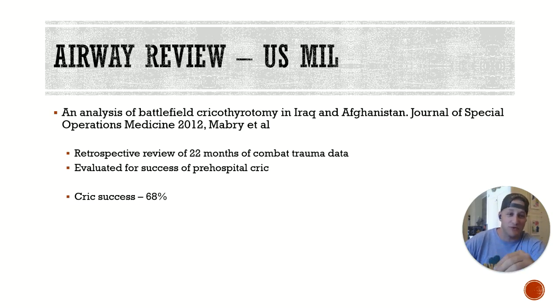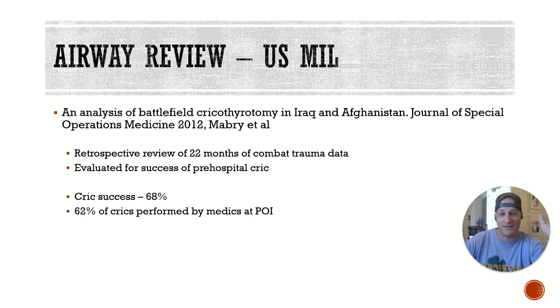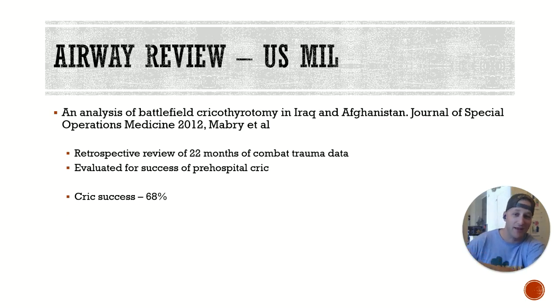All right. If we're saying the airway is a huge problem and it's potentially fatal if you don't have a secure airway, you just cannot tolerate 2/3 success. That's awful. Okay. 62% of the crics performed by medics at POI. Just to labor this again, like 3 out of 10 people who got a cric made it to the hospital without their cric working. Do you think any of those people survived? They certainly all died. Most people with the cric actually died. But if your cric isn't working and you've moved on to other treatments, you're definitely going to die.